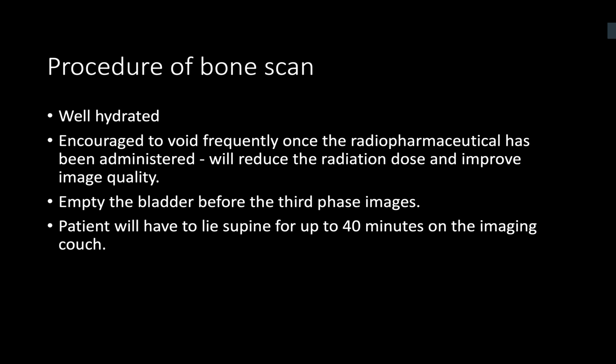I would also want them, after the scan, to stay away from any pregnant relative or anyone known to be pregnant. This would be the main precautions, actually.